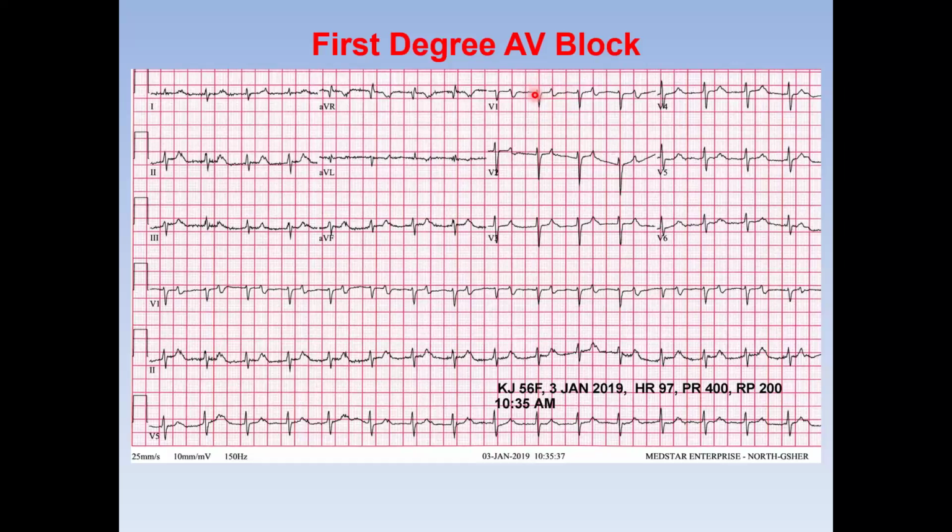As the rate gets faster, the P is much closer to the QRS complex. Basically, what happens in this kind of scenario is it develops some kind of pacemaker syndrome. That means the ventricle is contracting almost close to where the atrium is contracting. And this is at a rate of 100. I'm sure if the rate goes to 120, P will become closer to the QRS complex and it will cause symptoms. In some patients, it causes symptoms. This patient, 56, already had a pacemaker.